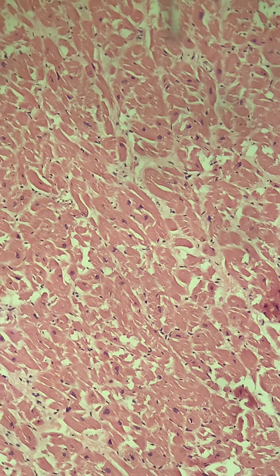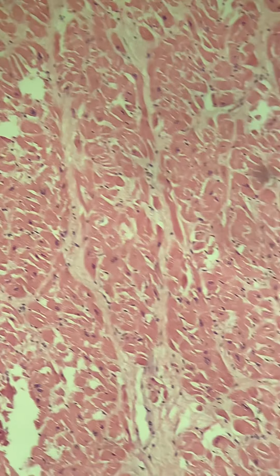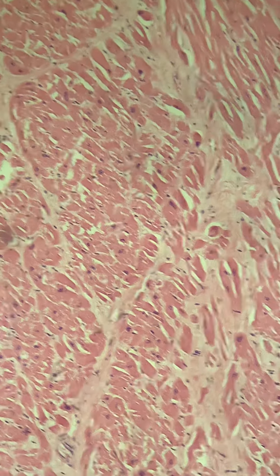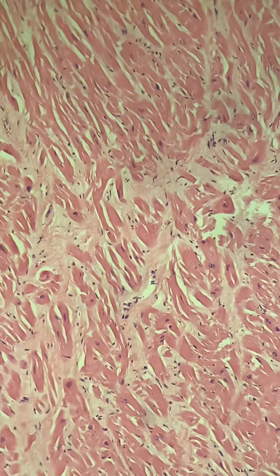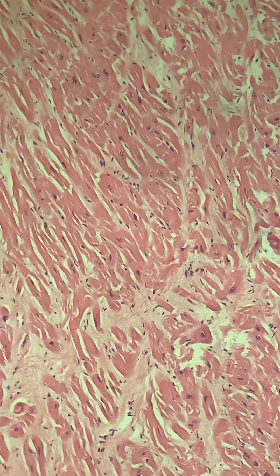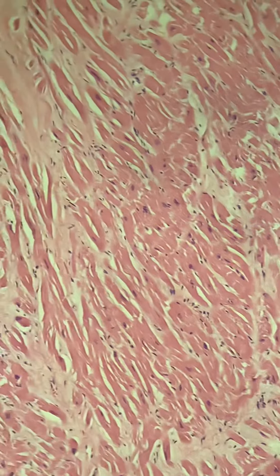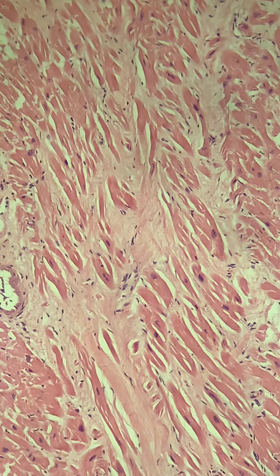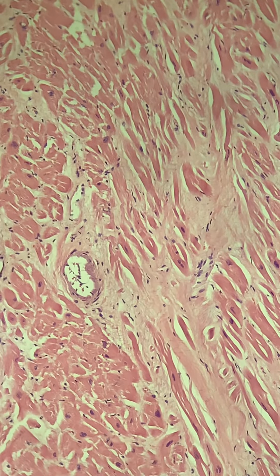I want to show this myocardium — relatively normal myocardium. Obviously the person had some ischemic heart disease at 80-some years old. This is a part of the ischemia where you see replacement fibrosis in between the muscle bundles, but there is no acute myocardial infarction or heart attack. There are some chronic ischemic changes there.